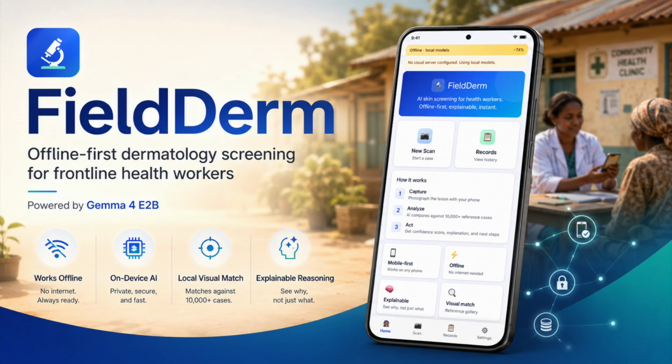How will the model know whether this is a disease or not? Because LLMs are trained on certain parameters and they don't have external knowledge of the diseases. So we created an embedded database for that. For each different disease, the user can download an embedded database onto their local mobile phone.